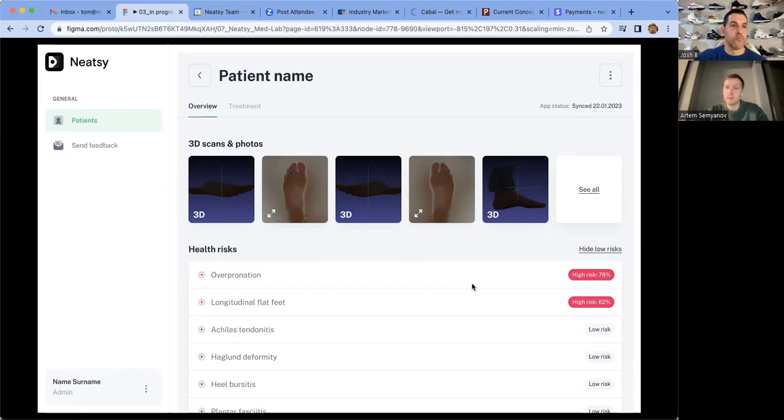I'm sure there's going to be a lot less no-shows because they're scanning their feet and that's sending it to you. A no-show for us costs $150 to $200. Second thing is they're curious about that scan. And even going to the next level, all of our scanners for custom orthotics are 3D scanners, a little bit different than what you do because we have to position the foot, but it's almost preparing them for when they come in and we're going to do a real 3D scan of your foot so we can mold your orthotics.